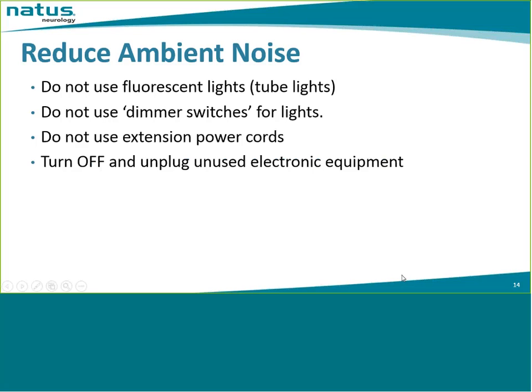Many times we use electrical beds to properly adjust the patient. Do use them, but if it is causing interference, unplug them when you start the examination.